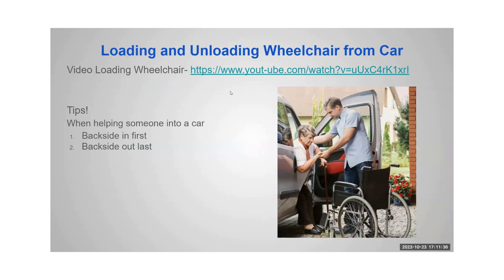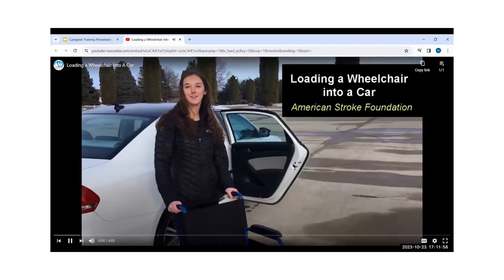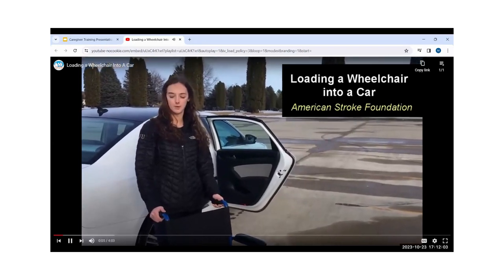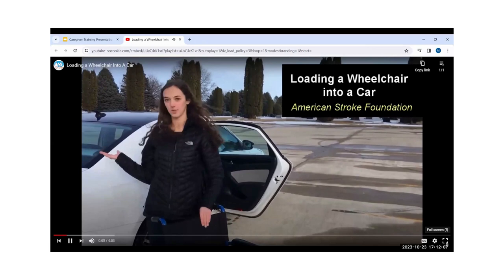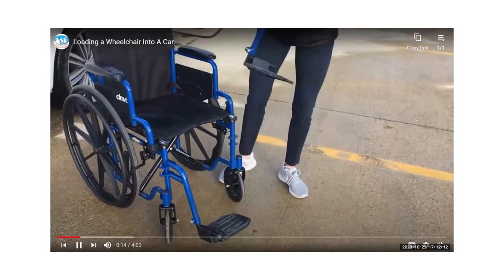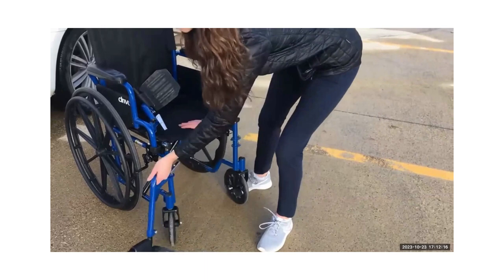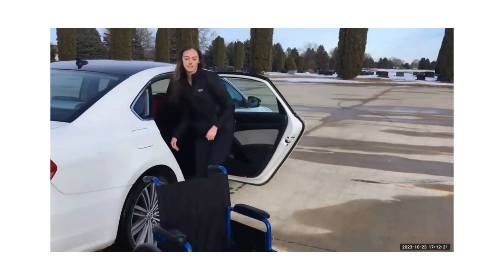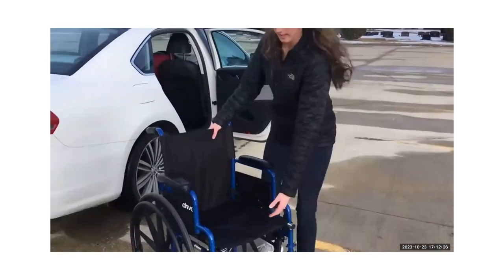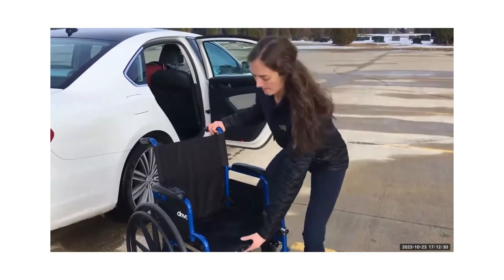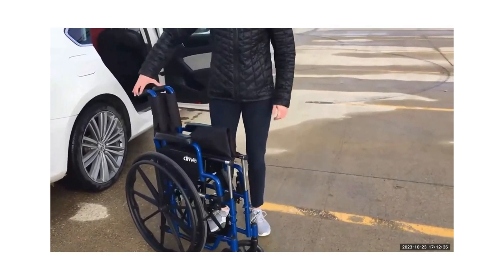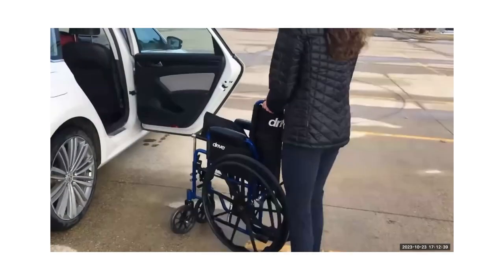Now let's watch a video on loading and unloading a wheelchair from the car. This technique works with sedans and SUVs — with practice it'll make your life a lot easier and protect your back. Step one is to take off the wheelchair foot rests, usually by pulling a lever underneath the wheelchair and twisting them off. Place these on the back seat of your car. Next, fold the wheelchair up by pulling up on the seat cushion, bending with your knees, and folding it into the middle. Then wheel the wheelchair close to the car.